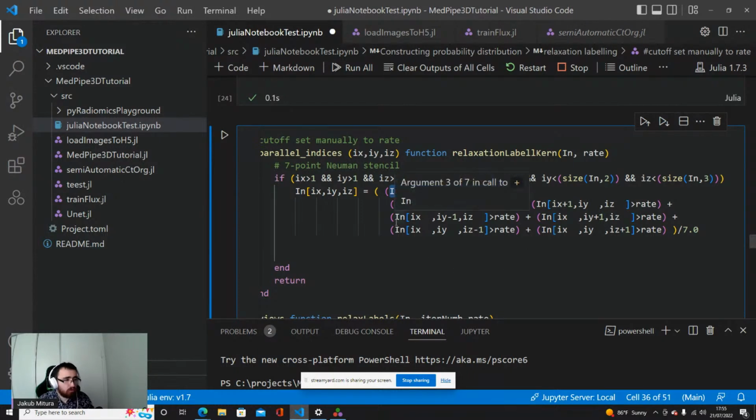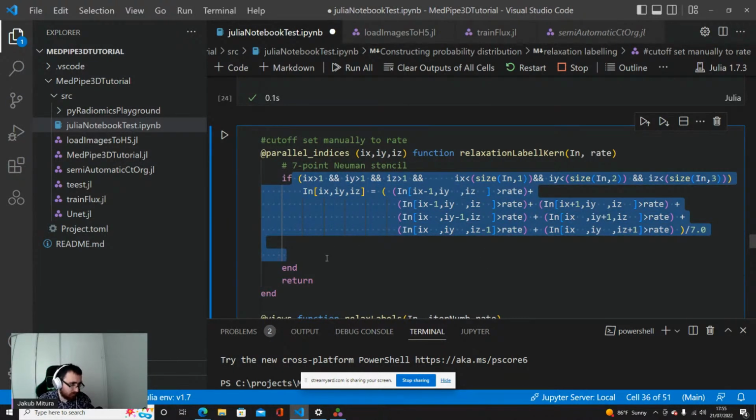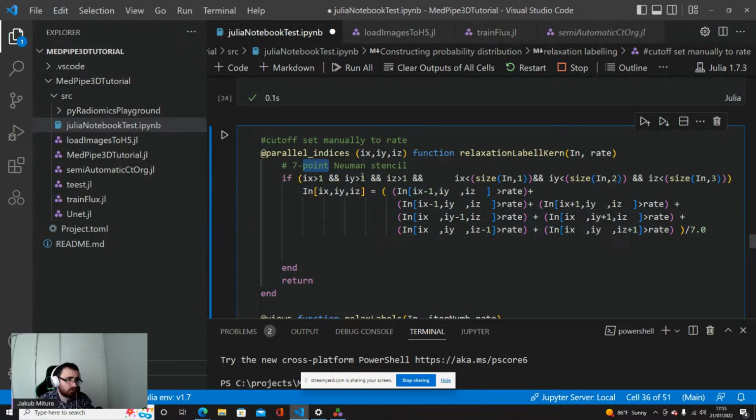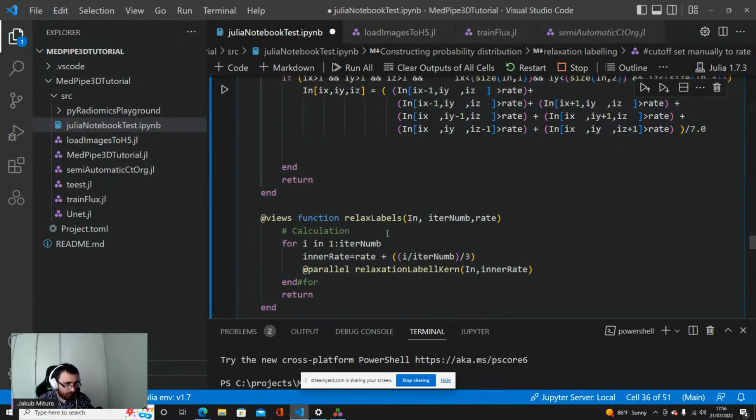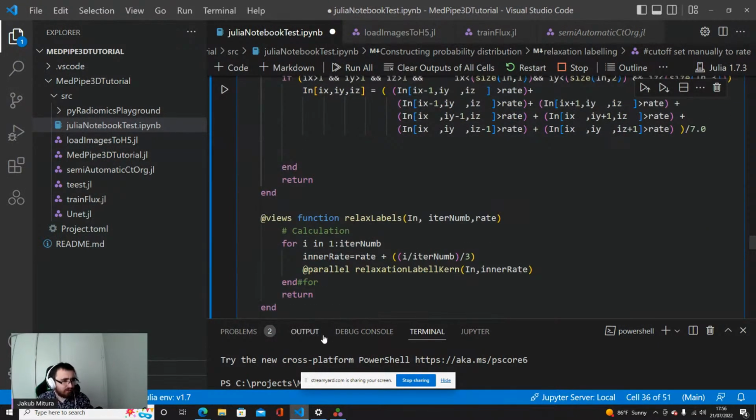So I'm choosing here -1 in x direction, +1 in x direction, +1 in y direction, -1 in the y direction. So all points around, and I get some mean. This is the 7-point Neumann stencil, basically. So I'm not looking in the oblique directions. And on the basis of this, I can define this relax labels function.